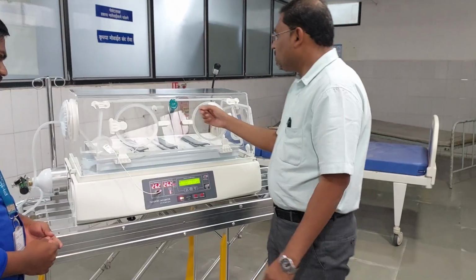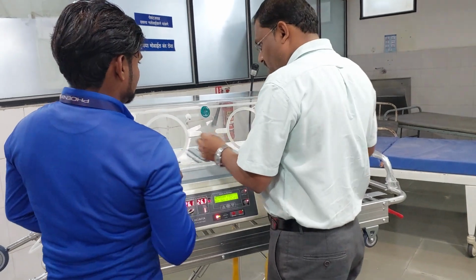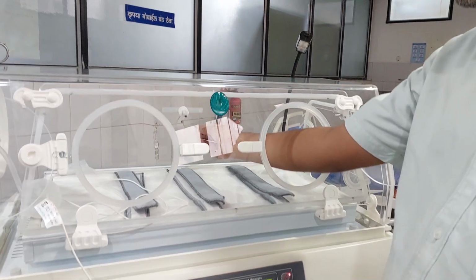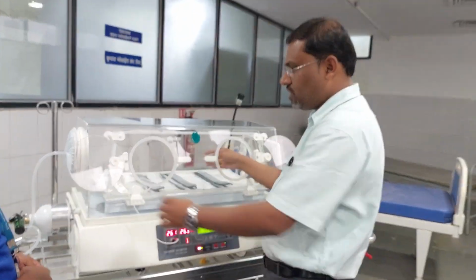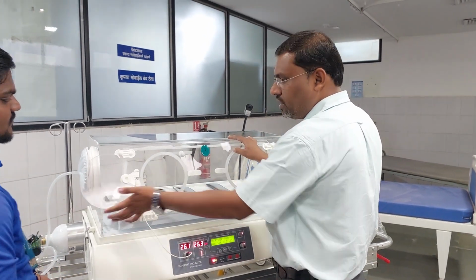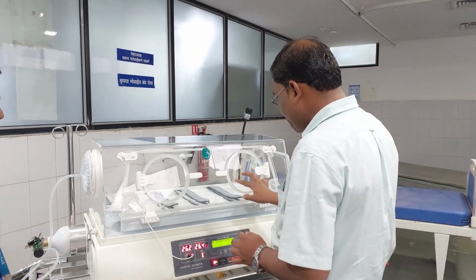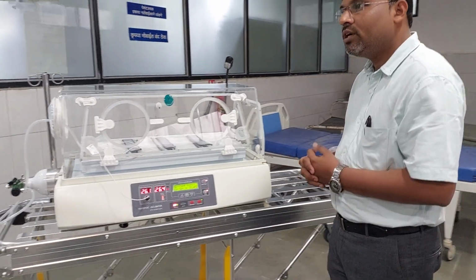One more thing, this is the air probe. So you have to keep it like this always, so it will sense the air temperature. And how to open it? See, just push it, it will get open. So this is the basic operation of the transport incubator.